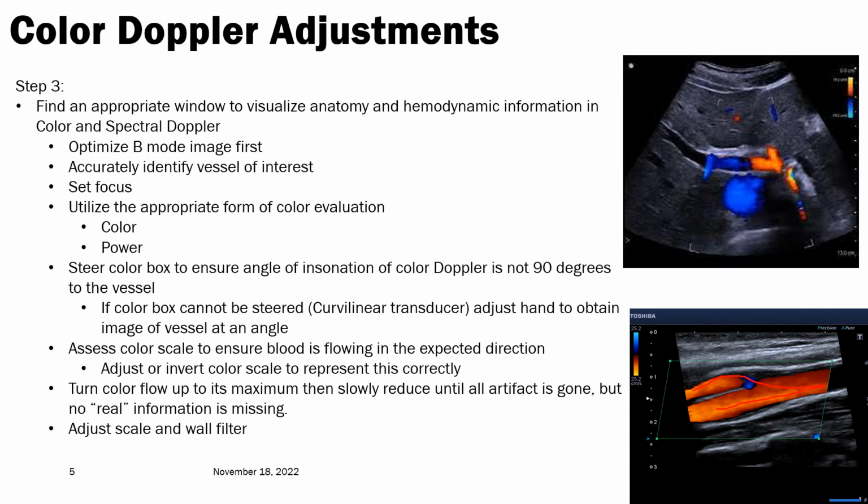And the other thing is, with our curvilinear transducer, it's pretty normal, just because the scan lines are divergent, that we'll see one vessel in red and blue. Now, most of our vessels, like in this carotid, it would be pretty uncommon for my common carotid to have flow going in multiple directions. If it's post-stenotic turbulence, then of course that would be reasonable. But if it's not turbulent, I shouldn't have color flow represented as blue and red. And if you're seeing that, that's going to be a problem with your scale.